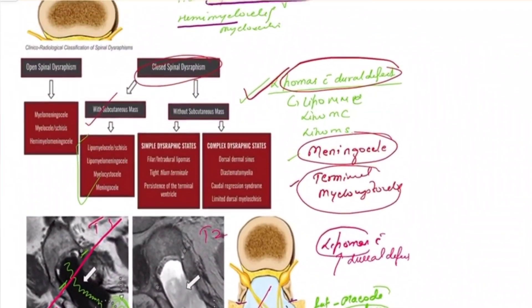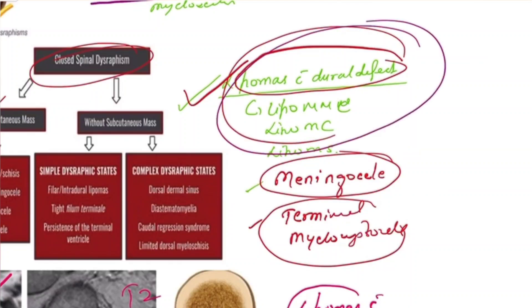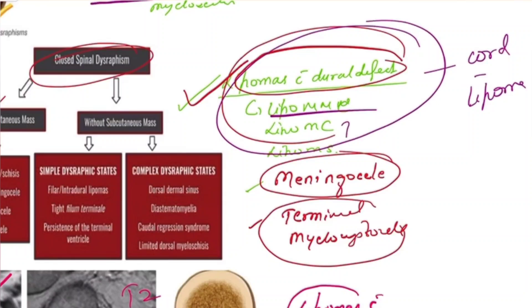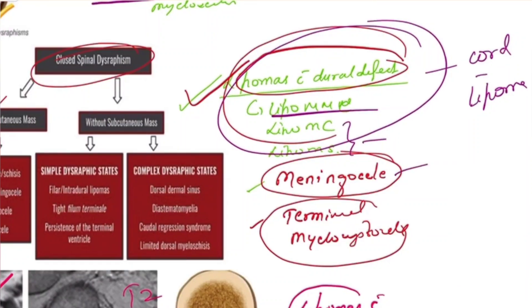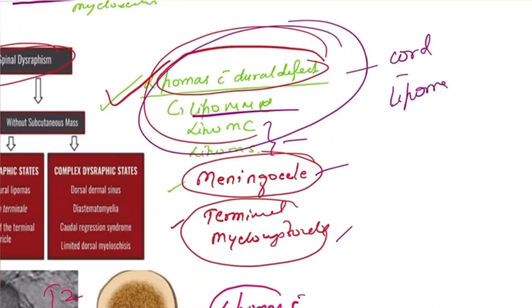In non-terminal myelocystocele, the posterior wall of the syringohydromyelic cavity herniates through the spina bifida into the meningocele, with the anterior wall of the spinal cord remaining in the vertebral canal. To summarize: in lipoma with dural defect, identify the cord-lipoma interface — outside the canal is lipomyelomeningocele, within the canal is lipomyelocele or lipomyeloschisis. Meningocele has no neural herniation; myelocystocele combines a meningocele with a hydromyelic cavity of the low-lying cord. See you in part two.